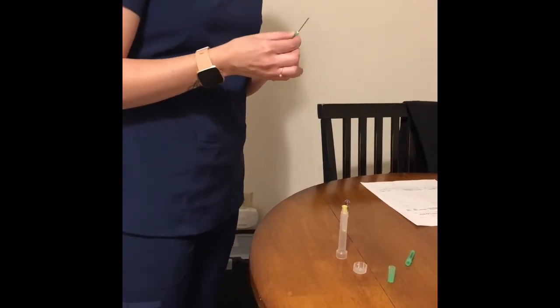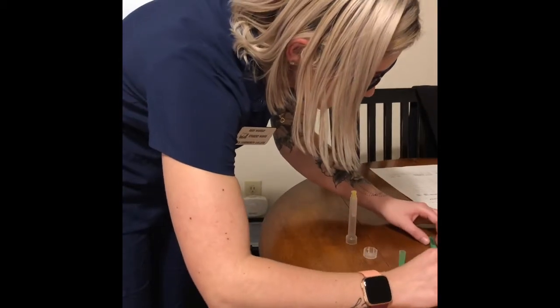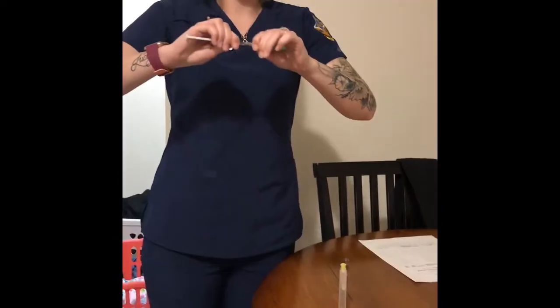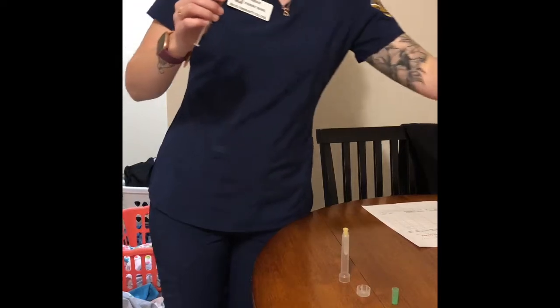So you're going to scoop it up. You're not going to touch it like I did. You're going to scoop it up, cap it, and put it straight in the sharps container. And this is also going to go into the sharps container.